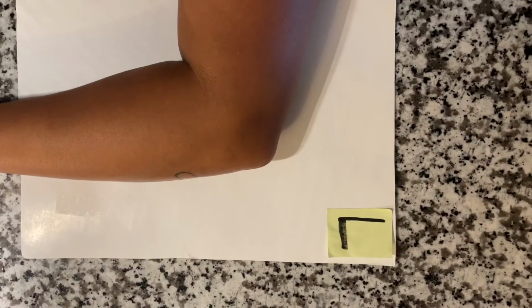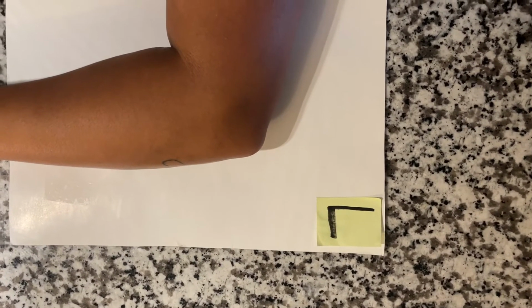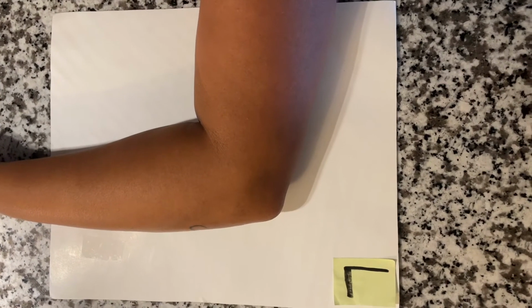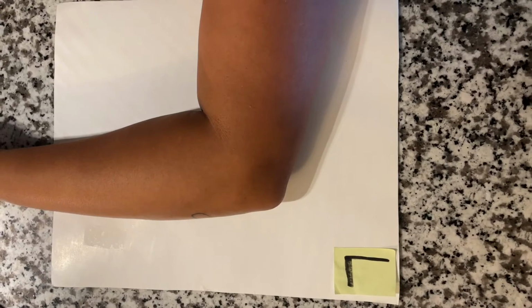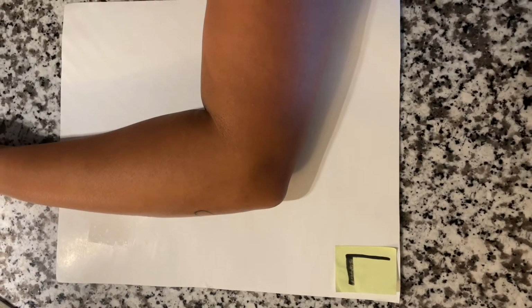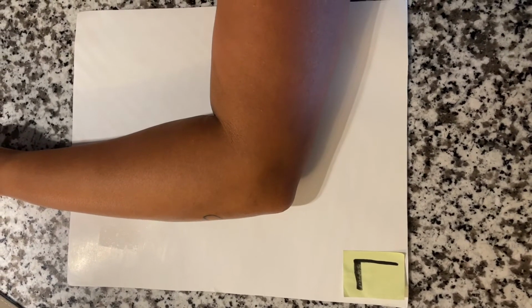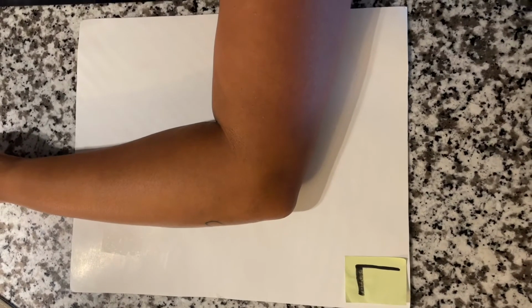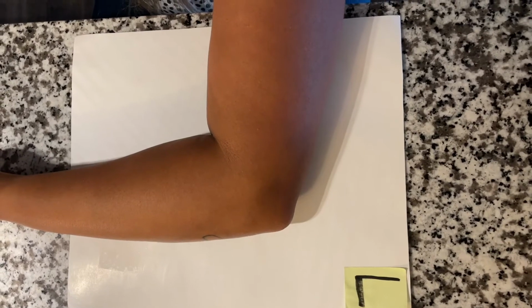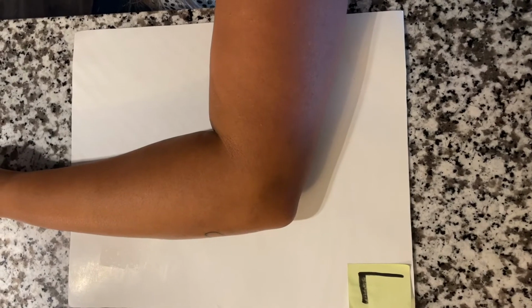For lateral elbow, the patient is seated with the elbow flexed 90 degrees. The shoulder is dropped in order to maintain a parallel relationship between the plane of the film and the humerus and forearm. The forearm and wrist are lateral. This should place a line through the humeral epicondyles perpendicular to the film plane. The center ray will be directly perpendicular to the midpoint of the elbow joint through the center of the film space.